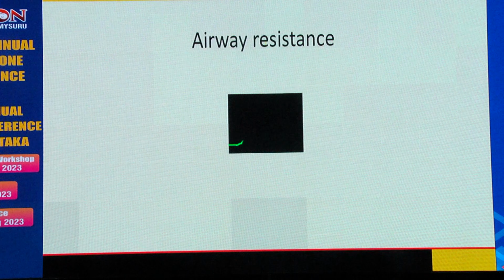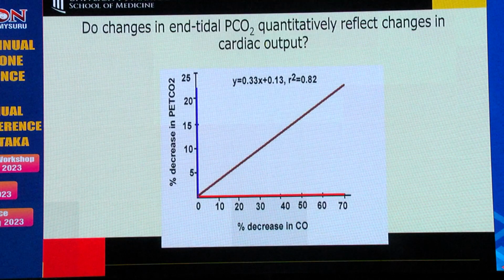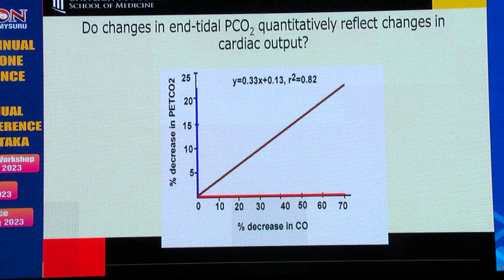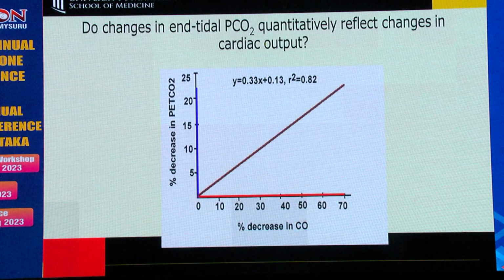You all know about a sloping phase 2 and phase 3 in classic asthma cases or COPD, and when you give them bronchodilators they revert back to normal. So, as soon as you put in an endotracheal tube, if you see phase 2 and phase 3 are prolonged, you know that you have actually created some bronchospasm or airway resistance within the patient, and that requires treatment.